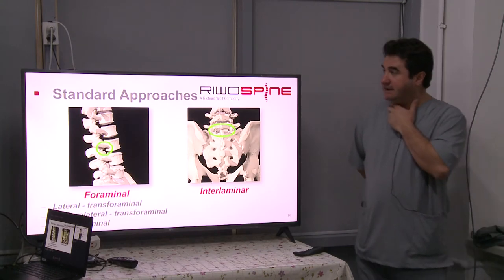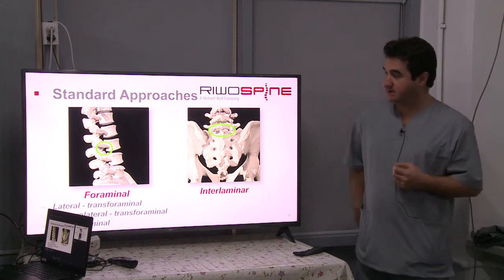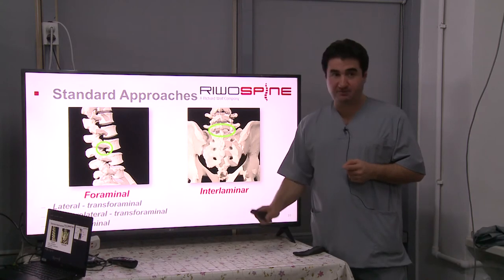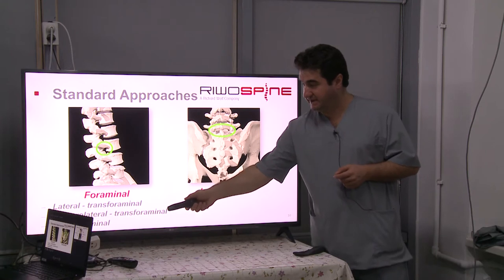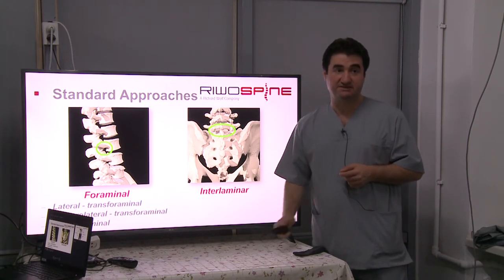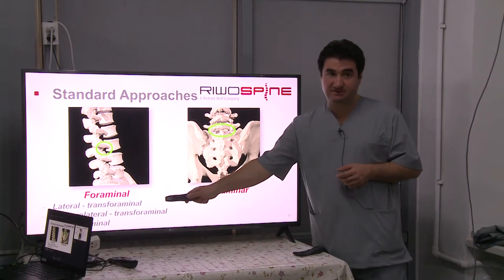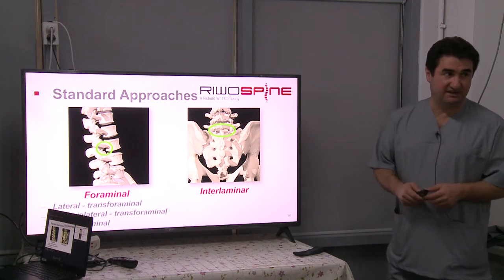And let's look at the approaches. We have two standard approaches here. One of them is the transforaminal approach. The other one we call the interlaminar approach. And we have three types of transforaminal approach: lateral transforaminal, posterolateral, and extraforaminal. I think this is clear.